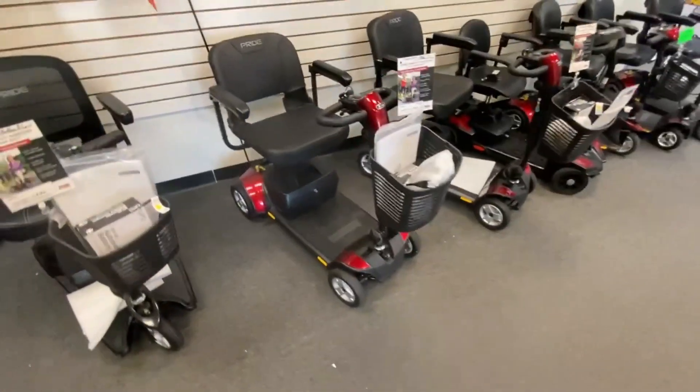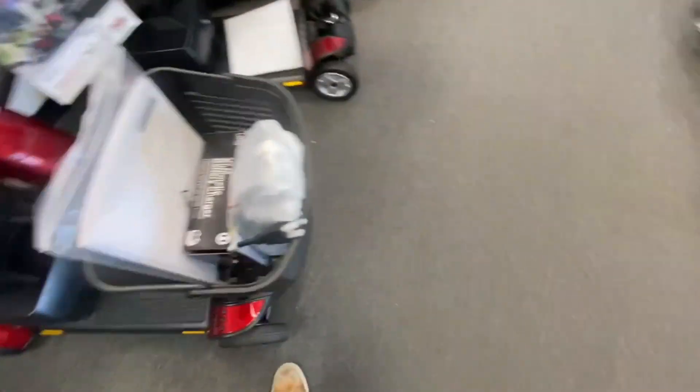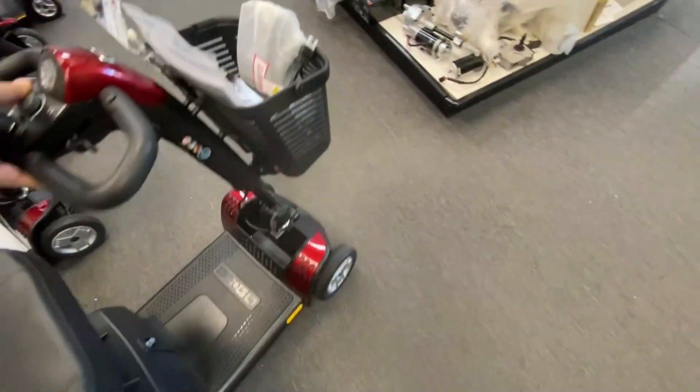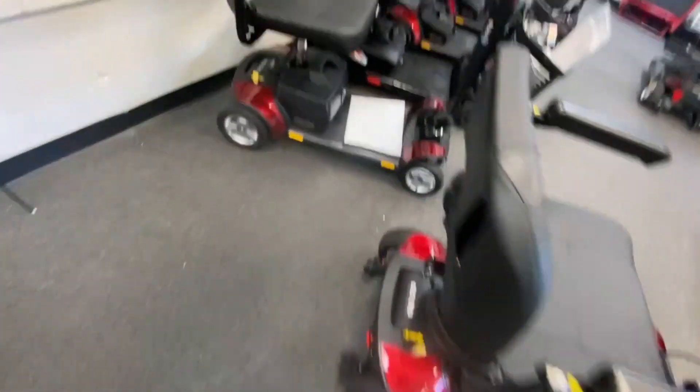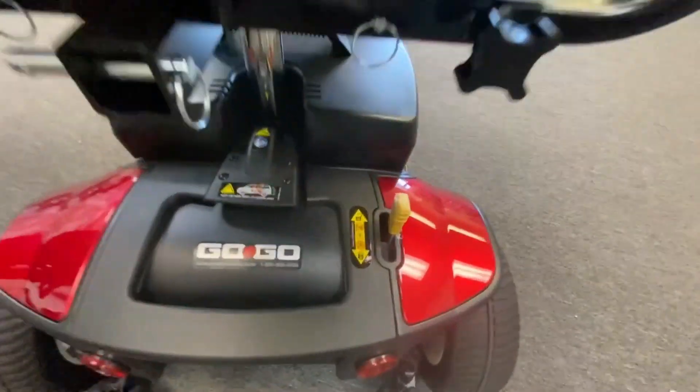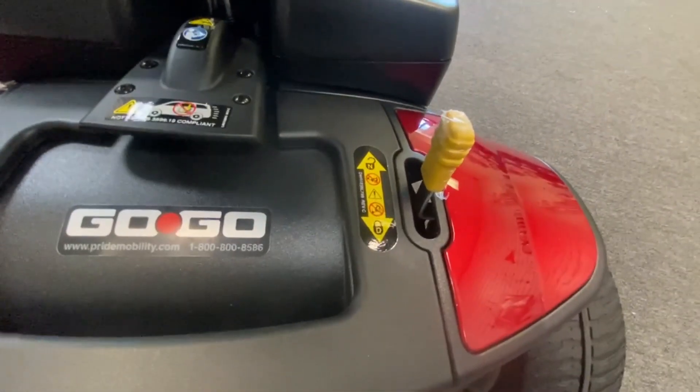They'll move the scooter around or they'll catch the handle and forget that they've caught it, or somebody caught it by accident lifting it in and out of the car. So I'll give you a demonstration on one of our new scooters. That's basically what this little handle at the back here is — let me zoom in.